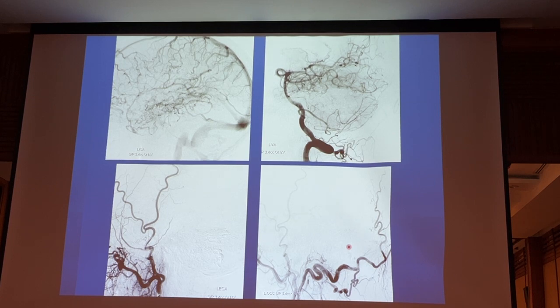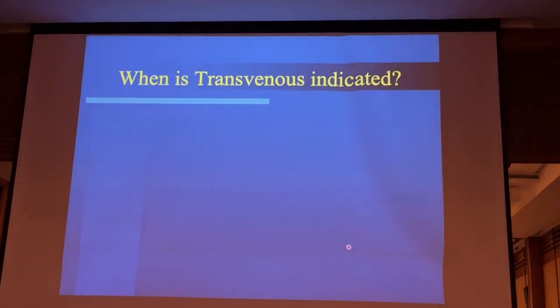Okay? He never really got the credit of introducing this material, and he never really materialized it to clinical use that widely. Okay? Anyway, in the era of Onyx, what is the indication of the transvenous approaches?